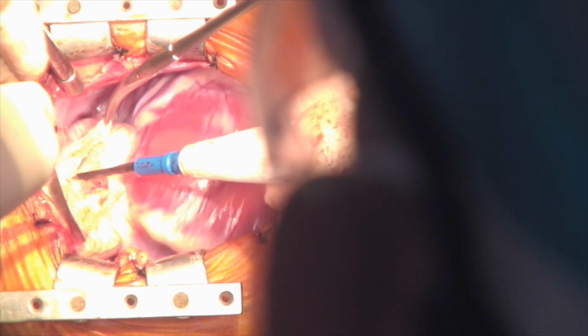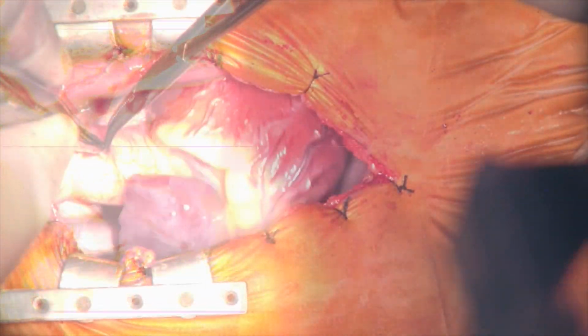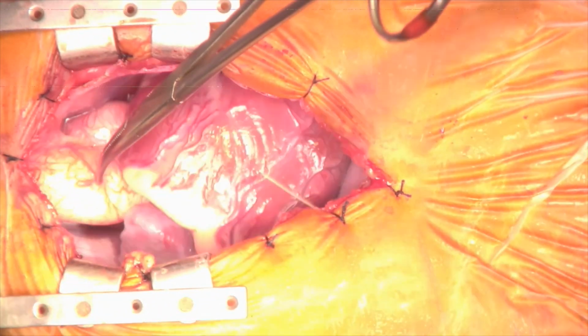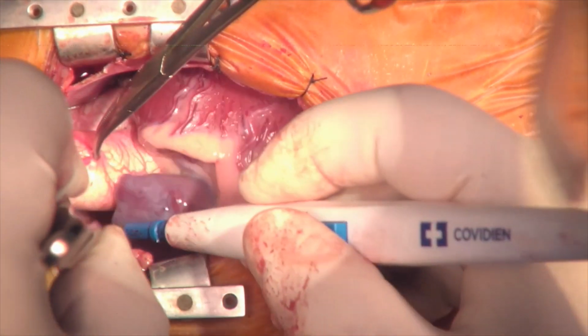The interarterial plane between the aorta and the pulmonary trunk is opened. The ascending aorta is drawn slightly forwards and off to the left. This is the right atrium and this is the superior vena cava.